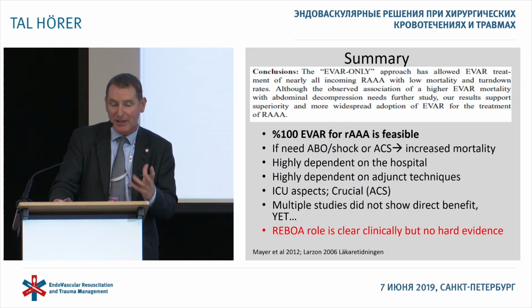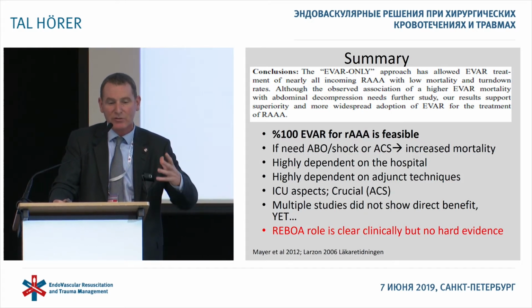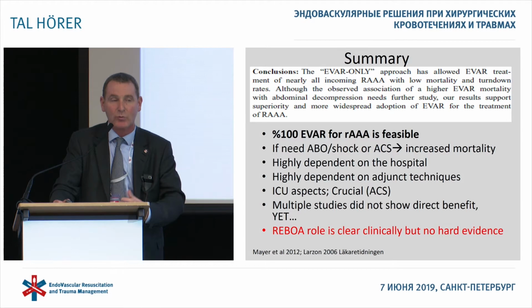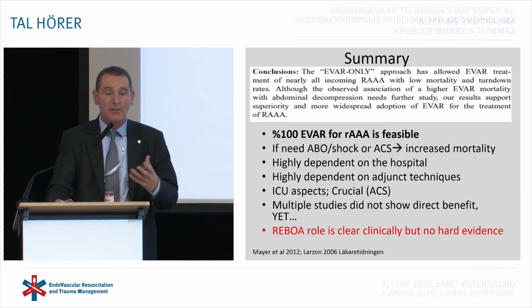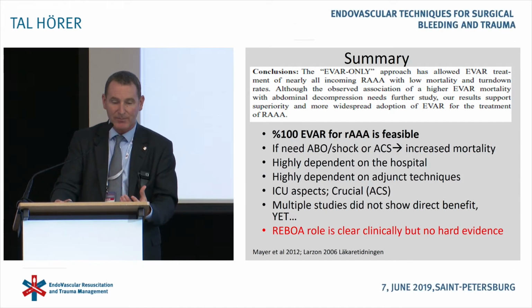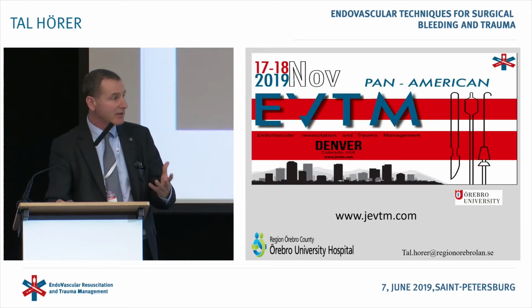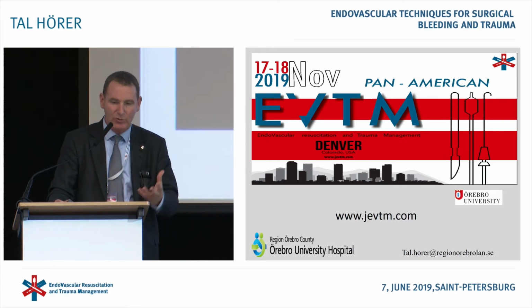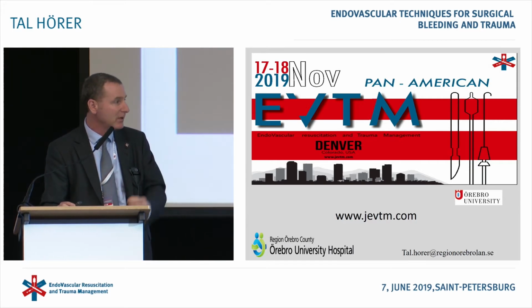And again, the balloon is just one of the tools. We can do all ruptures endovascular in general. At times it's time-consuming, and at times it will not work. But you have to think about the whole status of the patient, the hemodynamic status, what you can do and what you cannot do. And one of the things you can achieve with a balloon is to get some stabilization. And I think we have to investigate the role of REBOA and to see. We think it's clinically very good, but there is no real good data. We will discuss it here, and in Denver is the next stage, and of course on the different medias.